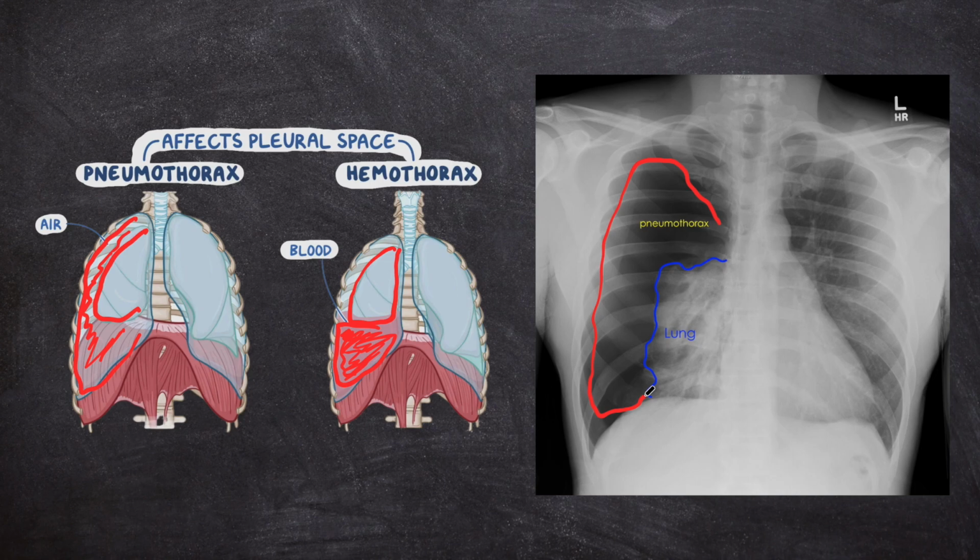Versus over here, you notice it's got all the striations and kind of fuzzy look to it. And that's because that lung is fully inflated and you're seeing kind of all the pathways in the lung. This one, this is all just air on the right hand side. So it shows you how much more condensed that lung is on that side, because all the pressure is pushing it down and it cannot inflate. So that's a little bitty lung.